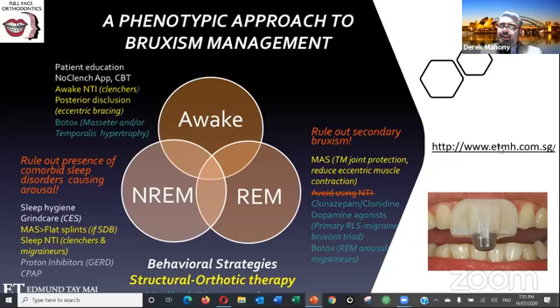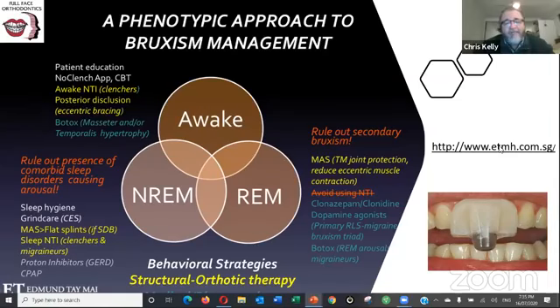See, the debate on the NTI, from my circle of dealing with people, is that prosthodontists never use them because they always say it's going to cause an open bite. And I say, well, it probably would if someone wears it 24 hours a day, because you can see the molars will extrude, because the incisors are intruding.